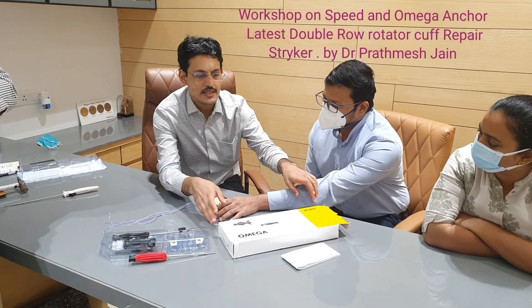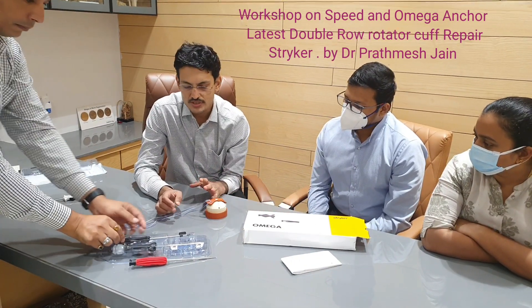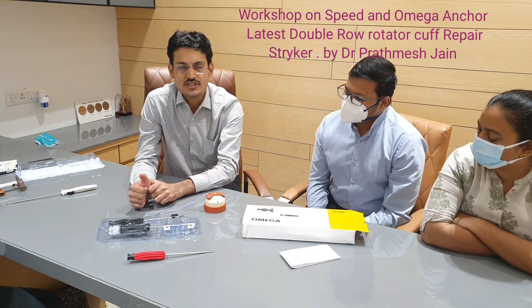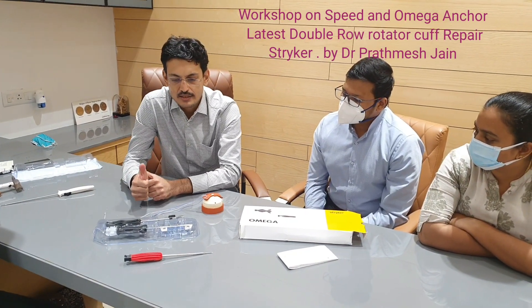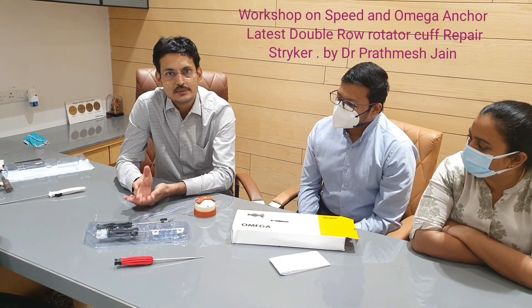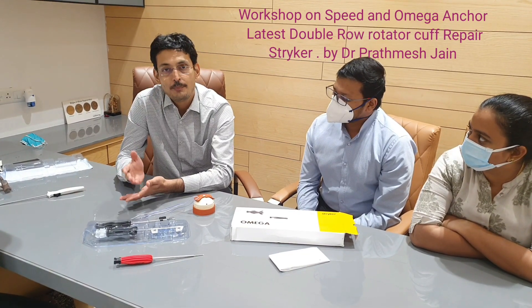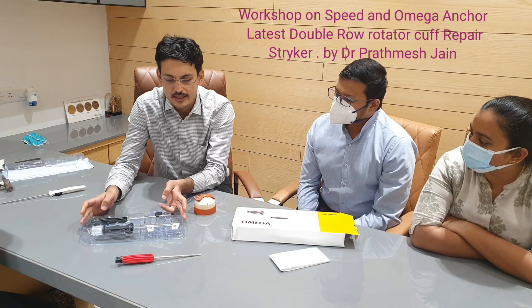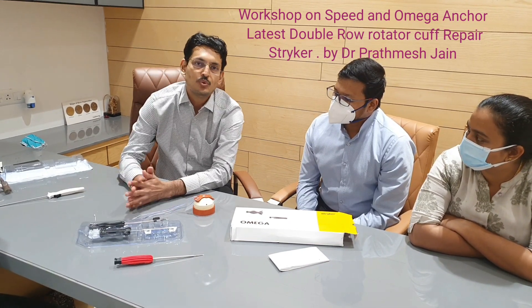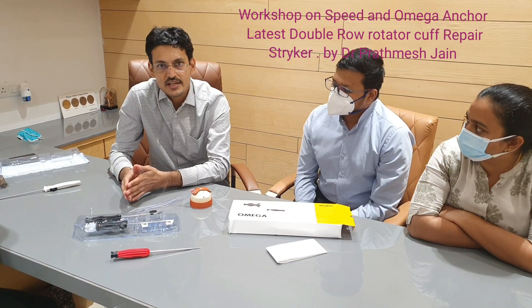The device I am demonstrating today is the Omega Nautilus anchor system. This is a very unique system because in one packet you will have two anchors which can be deployed. This anchor has the advantage of accepting a maximum number of sutures — you can actually use six tapes per anchor.